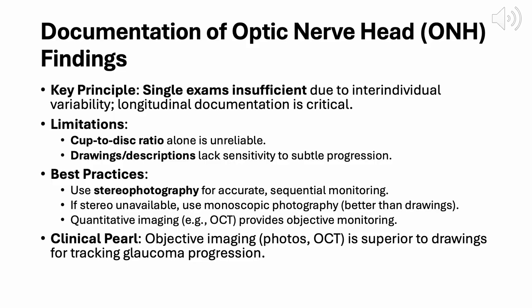It gives us a 3D view of the disc. If stereo isn't available, monoscopic photography is still preferred over drawings. On top of that, quantitative imaging tools like OCT offer objective, reproducible data that can highlight progression more clearly than the human eye. Here's the clinical pearl.